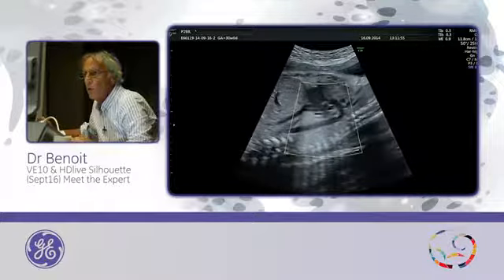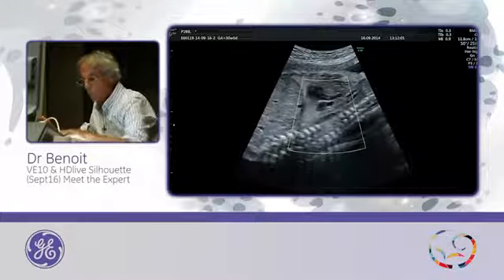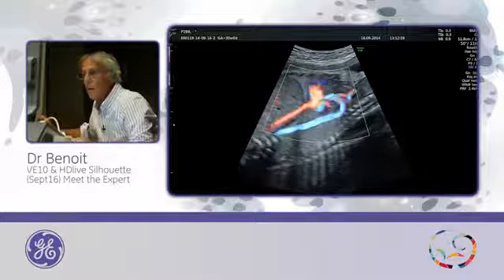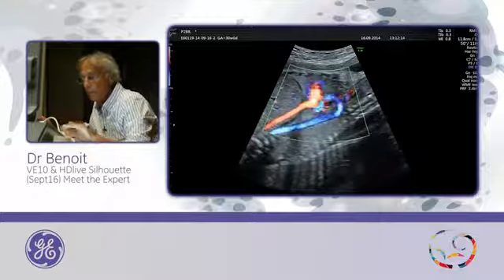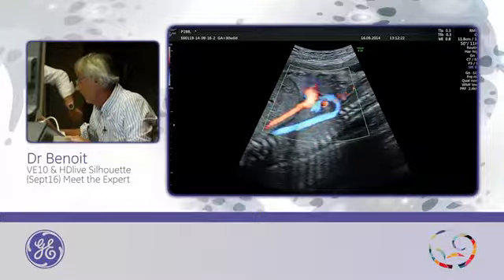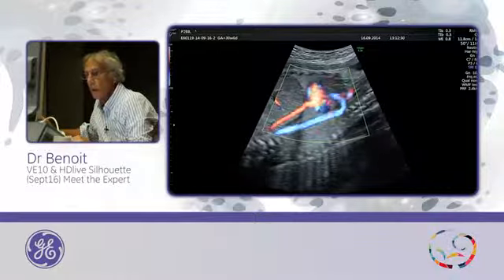So we will do a nice view of the aortic arch. Okay, I will do it with a static. I have 17 minutes. Until? It's now quarter past 1, so until 1:30. It finishes at 1:30? Yeah. Okay, so I do this and we'll open some cases. So this is the aortic arch.